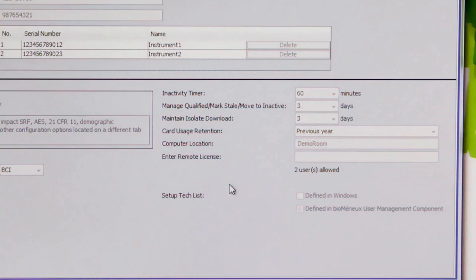If the isolate has been in the active workspace for greater than the configured number of days, the isolate cannot be sent to MILA or the LIS. This is to ensure that old isolates are not accidentally linked to new patients. The setting is based on how often you reuse accession numbers in your lab.